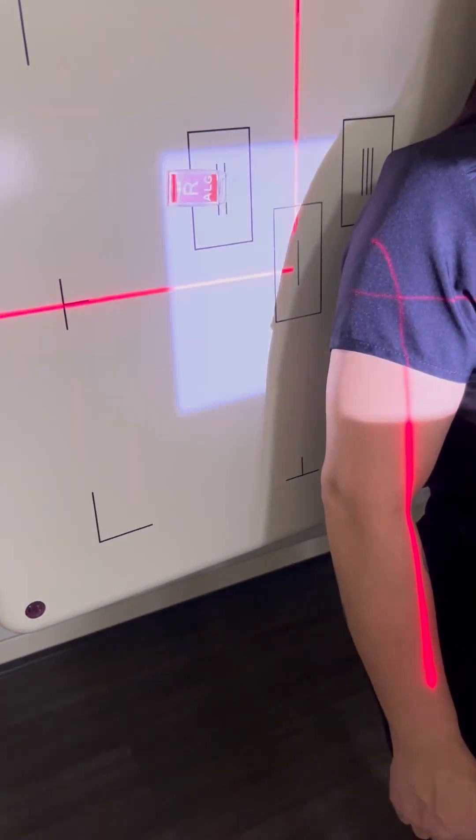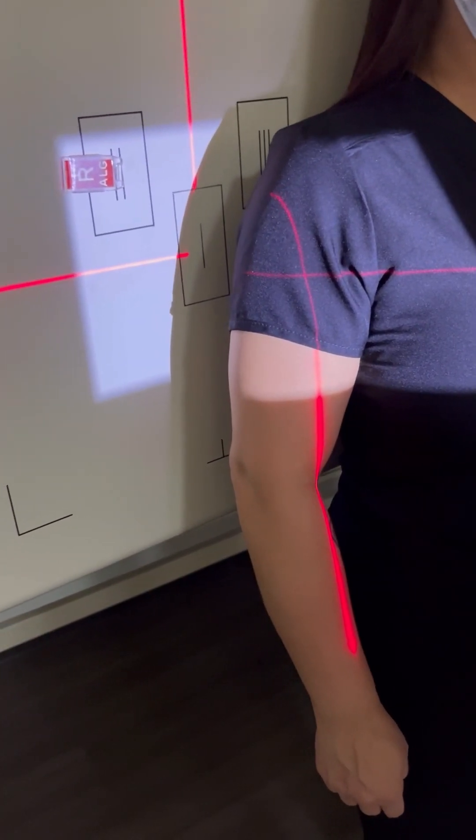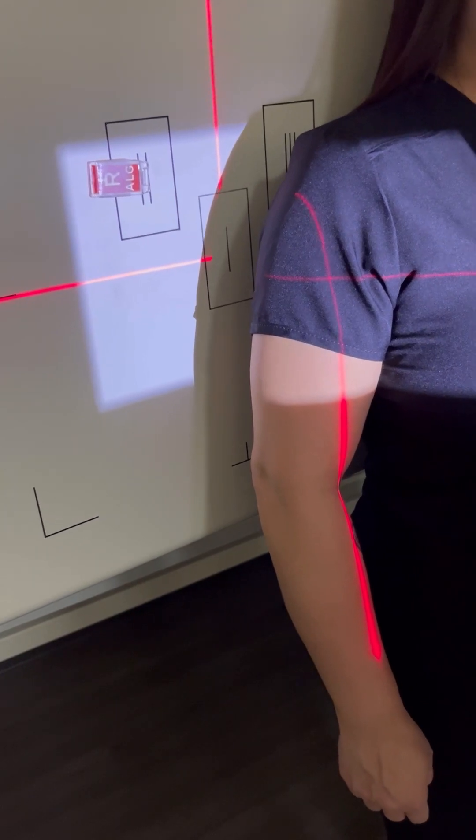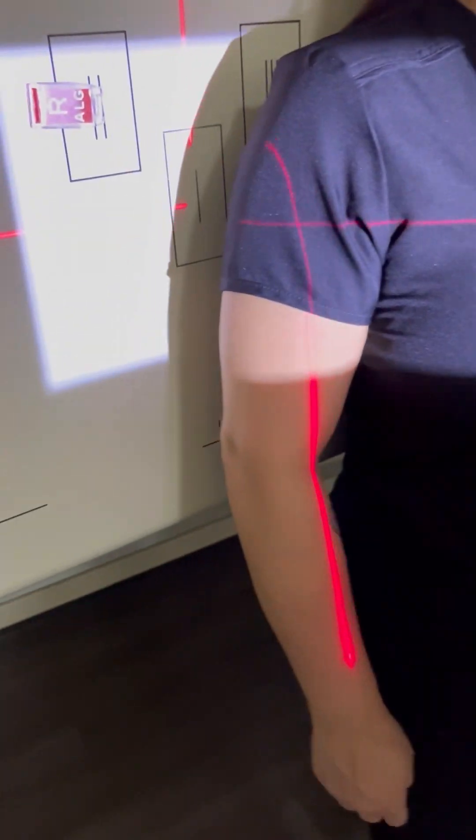Now we're going to do the right shoulder, and I always set it to 12 by 10, and then I can collimate if necessary.